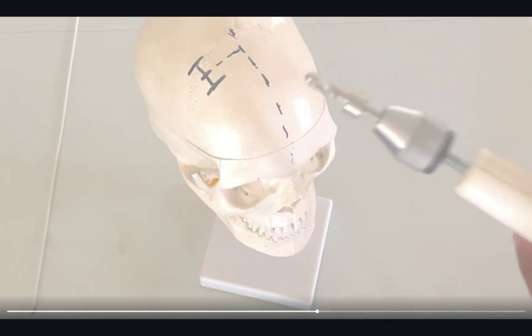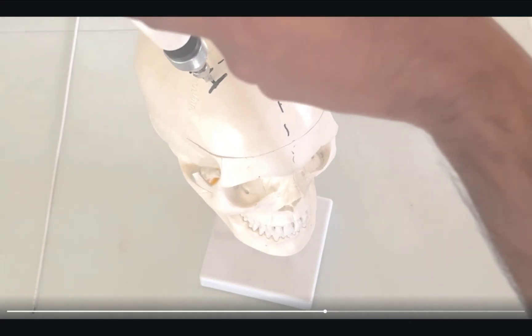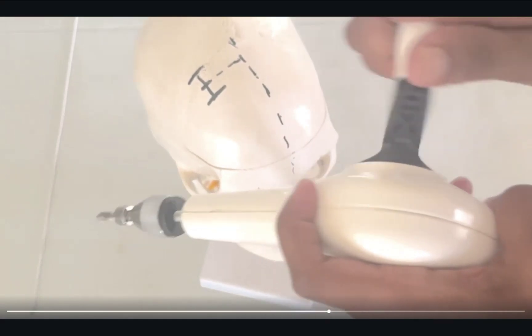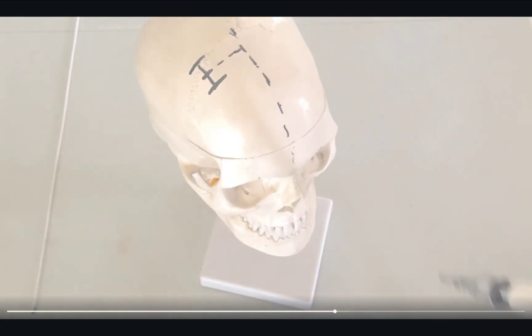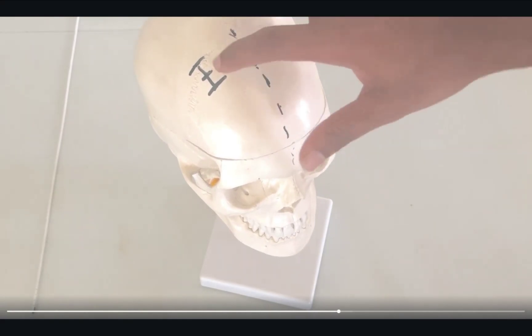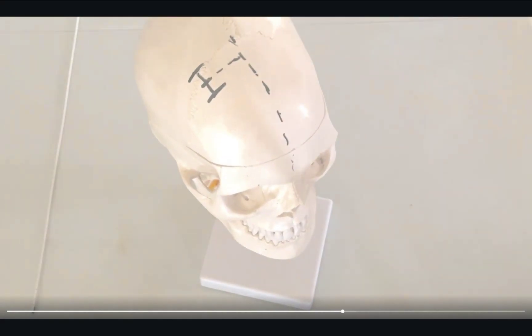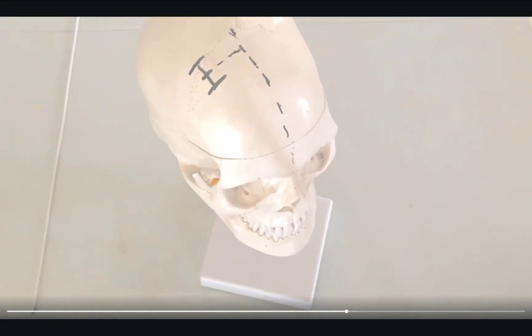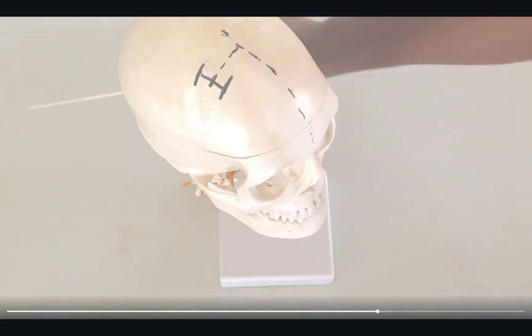Once you're happy with the depth, you'd place it perpendicular to that point. This one is just a manual drill, but the easier one is the electric drill. You would then perform the burr hole. You would then make sure that you've achieved hemostasis and bleeding is under control. Once you hit the dura, you'd want to do a cruciate cut, making a cross, then performing a corticotomy in the cortex, and then you're ready to put in your EVD.